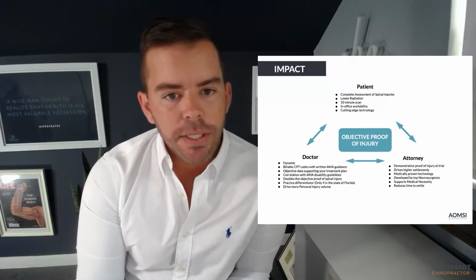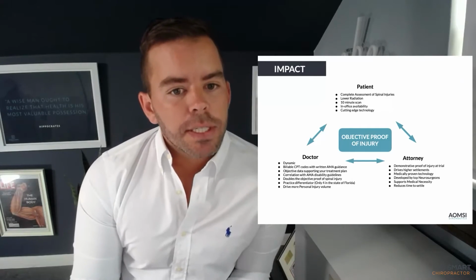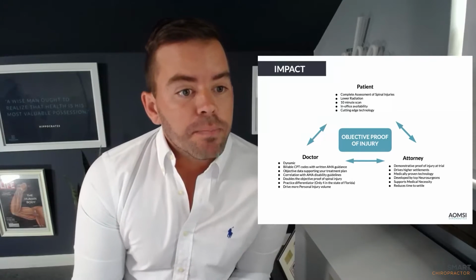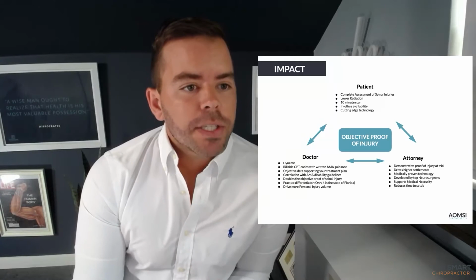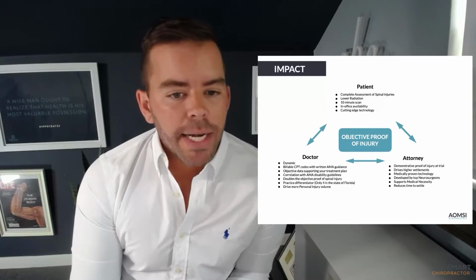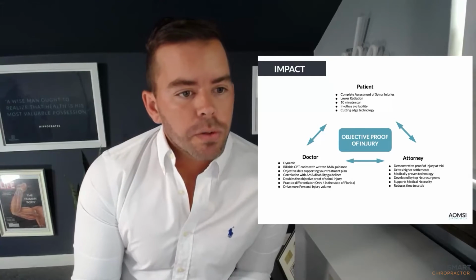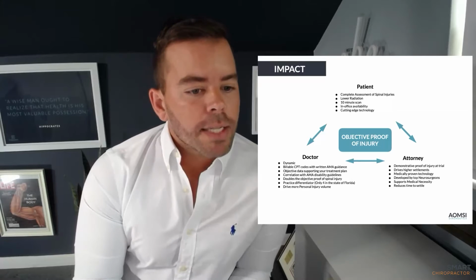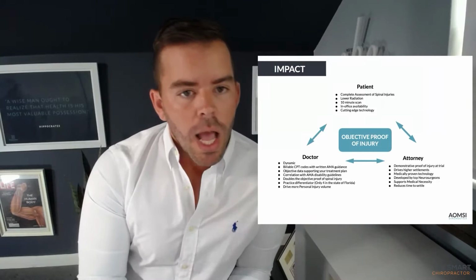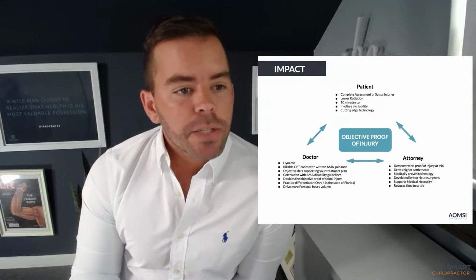And what we're going to dive into is really going to be, from a flexion extension standpoint, there's a lot that's missed. And actually with the VMA, we're going to have much higher sensitivity to pick up that instability, not surgical instability, but something that we could term as being clinically significant instability of the spine. A lot of times we have providers that will have patients that will come in with minimal findings, either on an MRI or an X-ray.